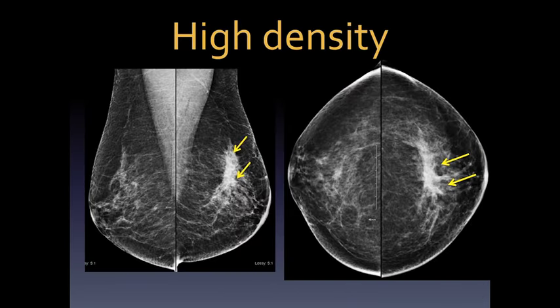Regional distribution is associated with malignancy about 26% of the time. It's calcifications that occupy over a two-centimeter area and don't conform to a duct distribution. Here is an example of regional distribution with extensive DCIS — it doesn't conform to a duct distribution and is not typically benign. Here is another example occupying more than one quadrant and more than two centimeters, in a regional distribution that turns out to be DCIS — also seen on MRI with non-mass enhancement.